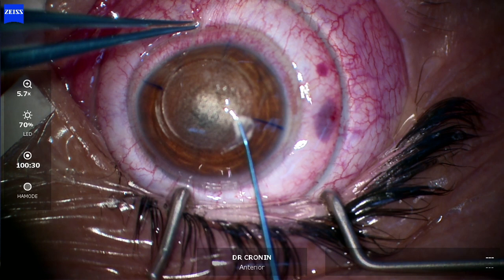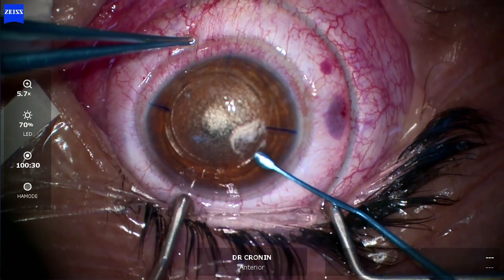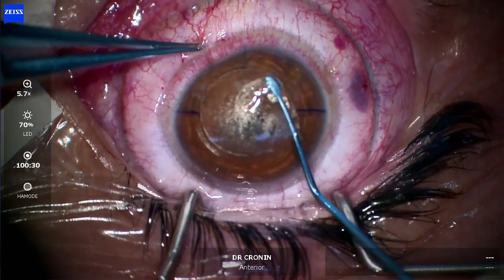You delicately dissect into the anterior plane in front of the lenticule that has been made with the laser, and then dissect that anterior plane in smooth movements, ensuring you go all the way to the periphery of the dissection.